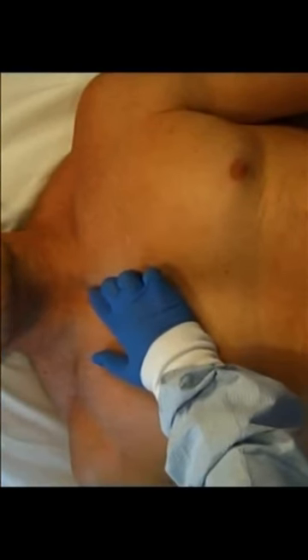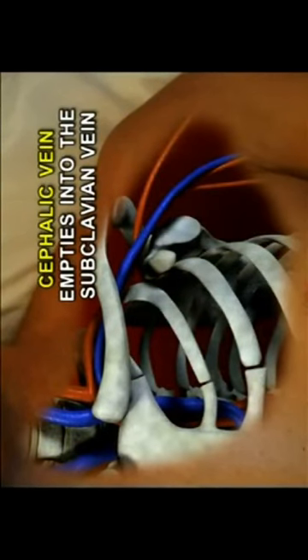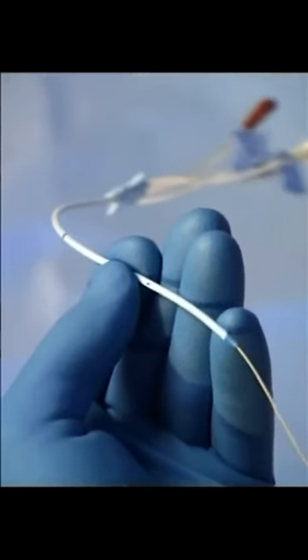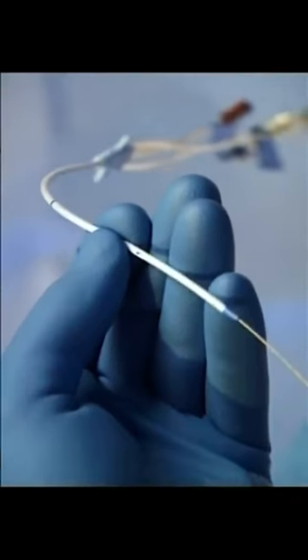The landmarks for subclavian line placement are the point on the clavicle that is 2/3 from the sternal notch to the shoulder. This area may also be noted by finding the groove between the muscles. It is in this groove that the cephalic vein runs and empties into the subclavian vein. After noting the insertion landmarks, the area is prepped and draped in sterile fashion. The modified Seldinger technique, threading the catheter over a guide wire, is used in almost all central venous catheter insertions.